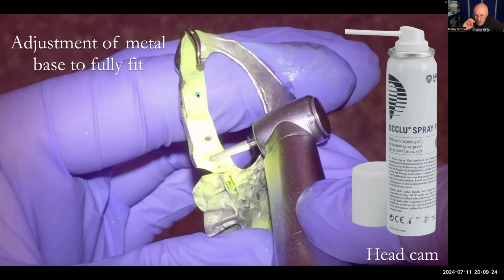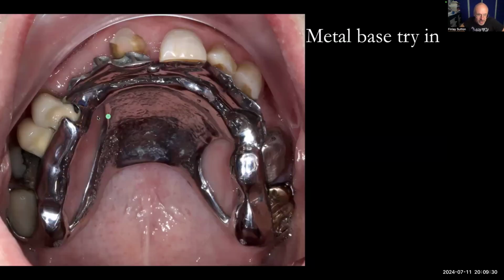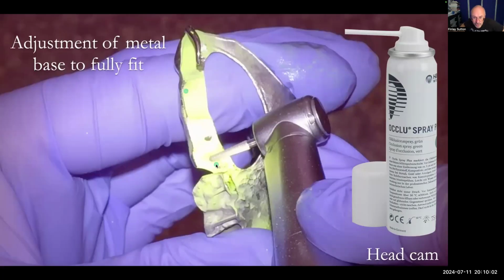But one area I don't touch is the collet edge. And the collet edge is this bit here, the part that touches the tooth. I'm happy to adjust it anywhere underneath this, Joanna, anywhere under it, but not on the collet edge, because if I adjust it there, I'm in danger of creating a gap between the tooth and the metal surface. So if we look here, that tooth there, if I ground that edge bit there, I would create a gap. So I would only adjust underneath that area, and it would absolutely be a last resort would I touch the edge bit.